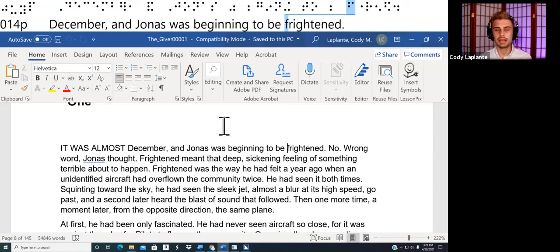This is in regular English. Why? A couple of reasons I know why. Number one, I heard that screen reader reading to me in my headphones on my audio system, right? So I know that the screen reader is reading it in regular English.